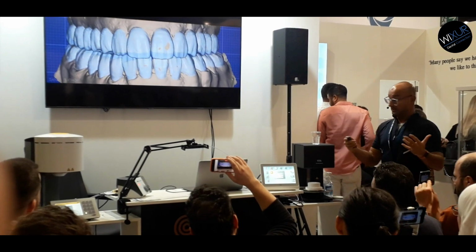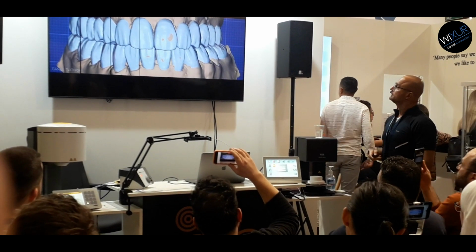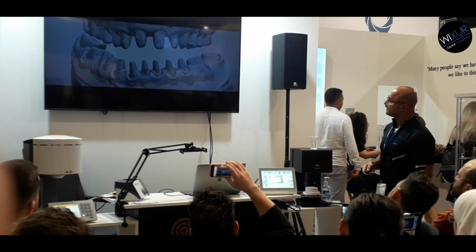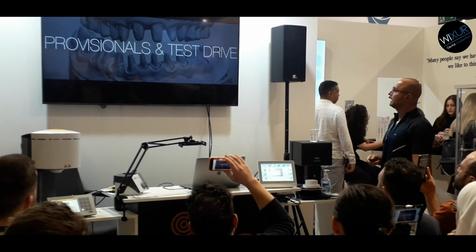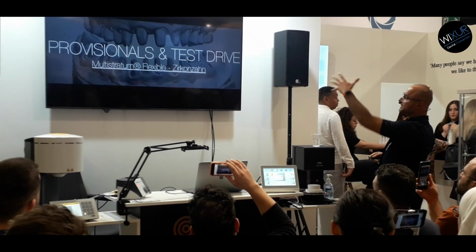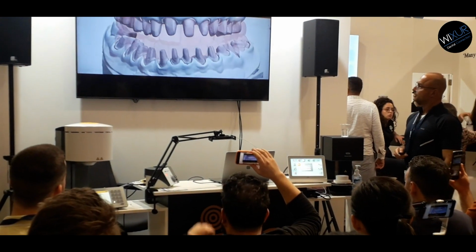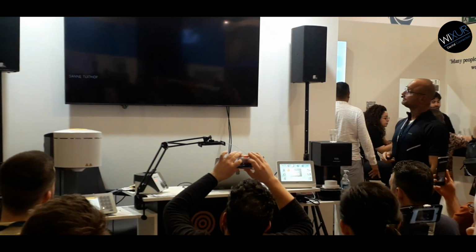It was very exciting for us, because finally we have the plan. She ground the old veneers and crowns, and using multi-stratum scan, we provided the multi-stratum provisionals to test drive it.